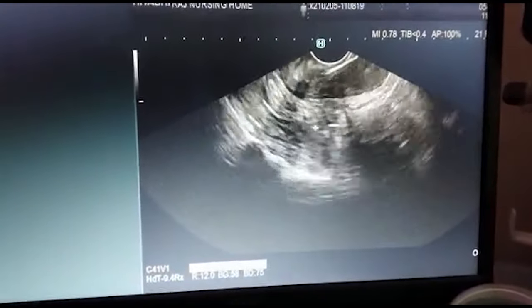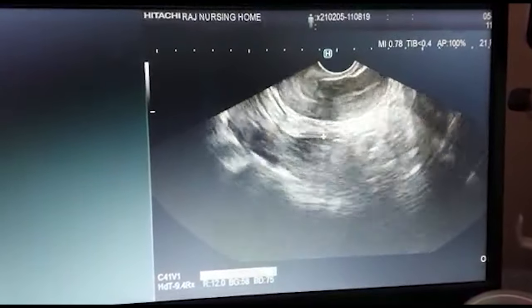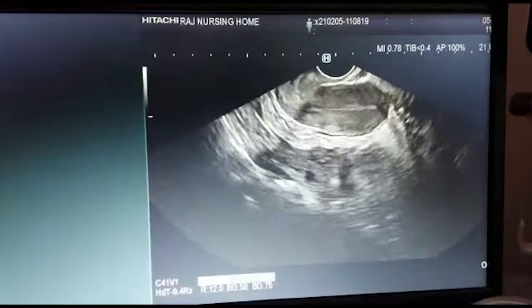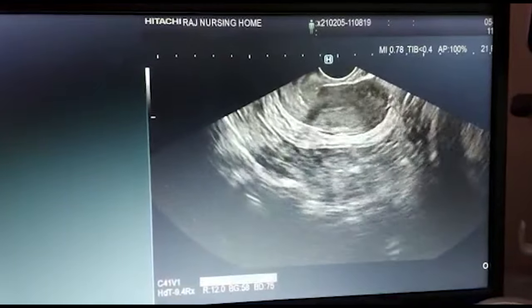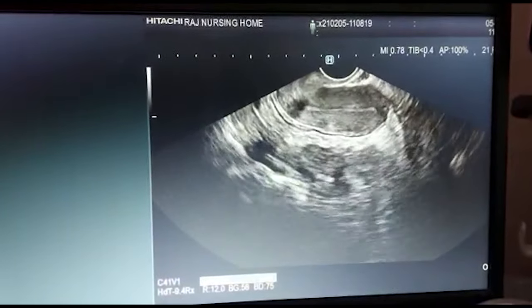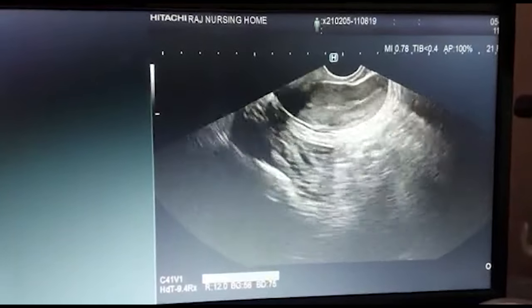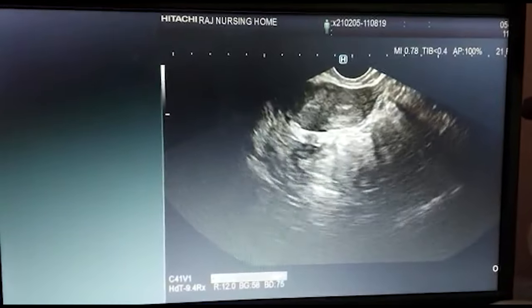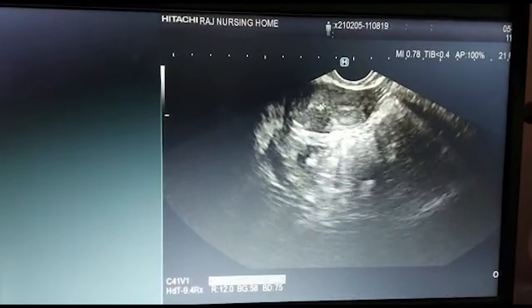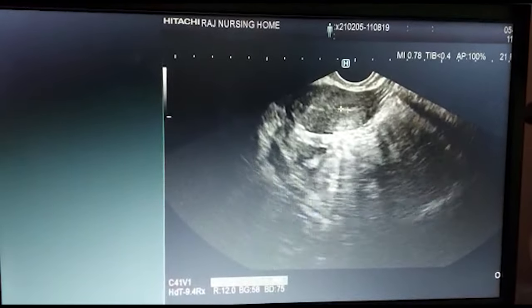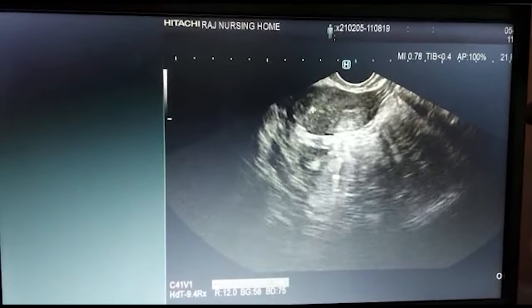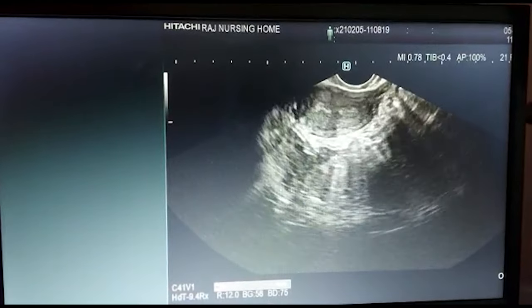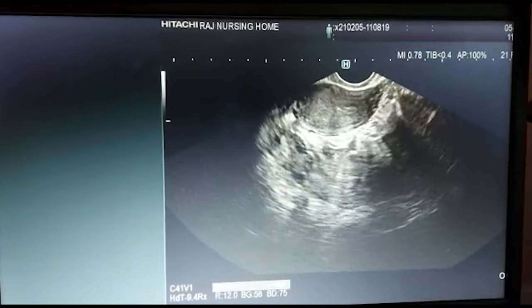This is a sagittal view of the uterus. If you only do the sagittal view, you are going to miss many things. Now I'll turn 90 degrees — you can see two endometria, one here and another one here, and slowly I am going down.